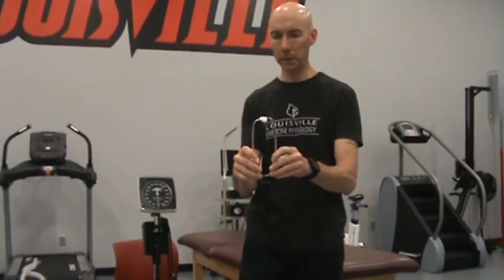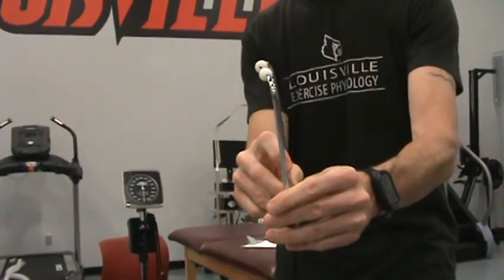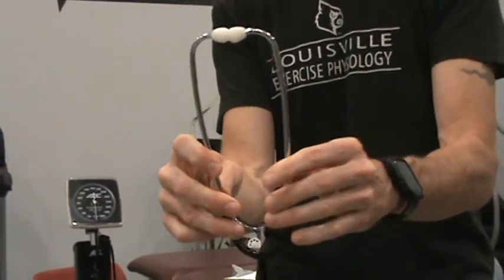So as you'll see, your hands are going to be busy when you're doing this. So I like to first take the stethoscope and put it around my neck so it's there. So when I need to use it, I can just use one hand and put the earpieces in. I do want to point out that the earpieces are often angled in one direction. Notice that they're angled forward slightly. When you put this on, you want to have the earpieces angled towards your face. The reason for that is because most people's ear canals are angled that way slightly, so if you put the earpieces in that way, you'll be able to hear better.